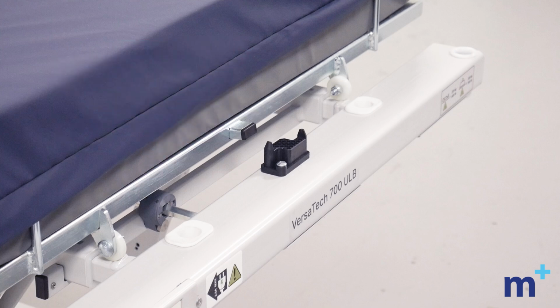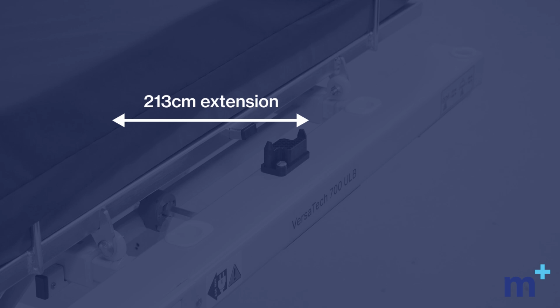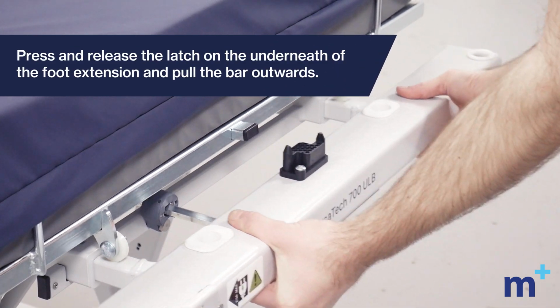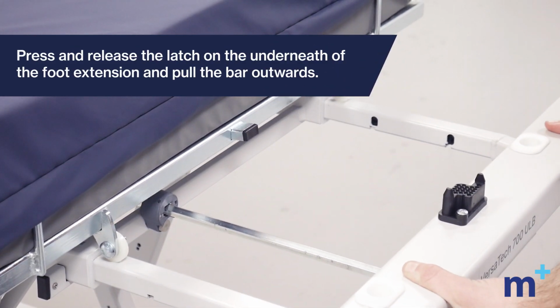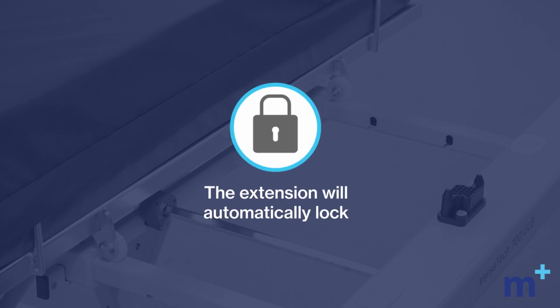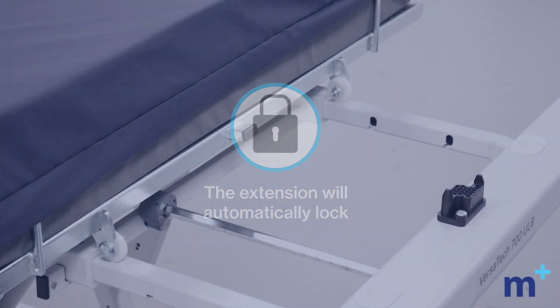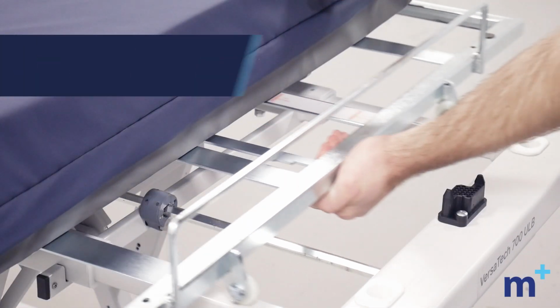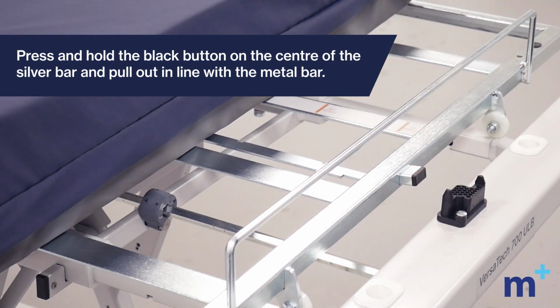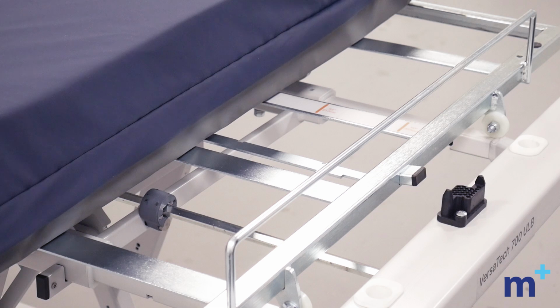The Versatech 700 can be extended in length from 203 cm to 213 or 223 cm to accommodate for taller patients. Press and release the latch on the underneath of the foot extension and pull the bar outwards. The extension will automatically lock at the 10 cm extension and the full 20 cm extension. Press and hold the black button on the centre of the silver bar and pull this out in line with the metal bar. Release the black button to secure.